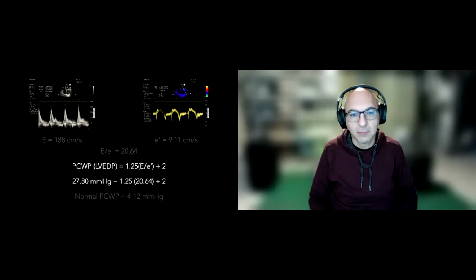And I'm saying this authoritatively because you told me this authoritatively last week. So I'm going to use, source, Ziad Shaman, right? But this is something you taught me, and I thought it was really interesting formula to then get a number on what we're seeing qualitatively, at least on the 2D echo.